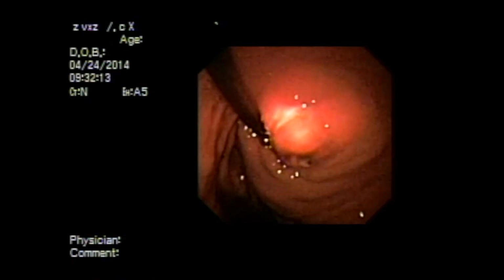The light of the pediatric scope is dimmed and the light of the dissecting scope is brightened. If the extent of the dissection is adequate, the light should be readily identified on the retroflexion view. Light pressure may be applied to the dissecting scope to further illustrate the completeness of the dissection. Once the extent of the dissection is confirmed to be appropriate, the stomach is desufflated and the pediatric scope is withdrawn.